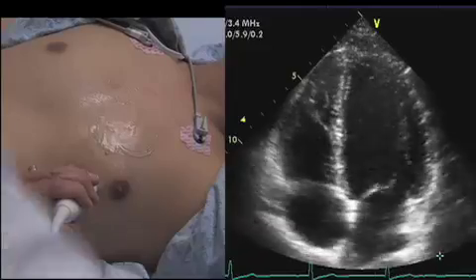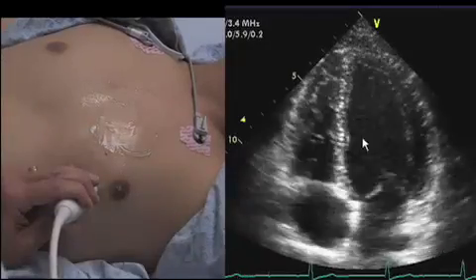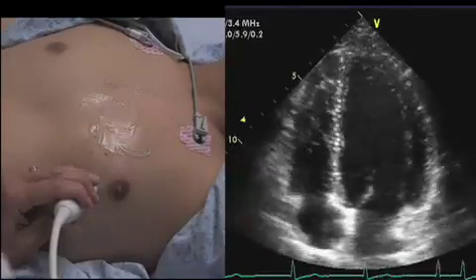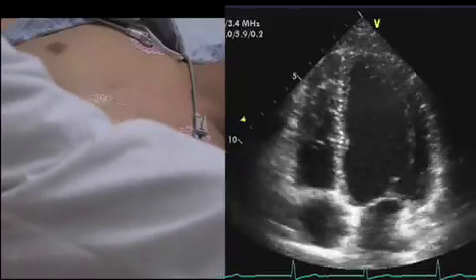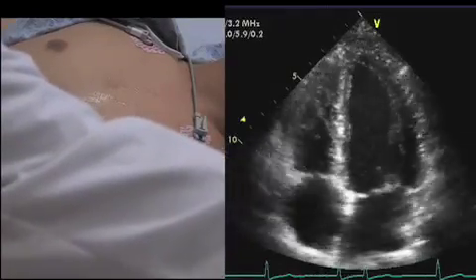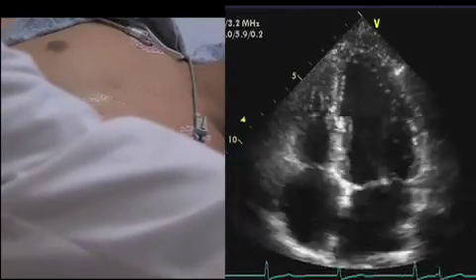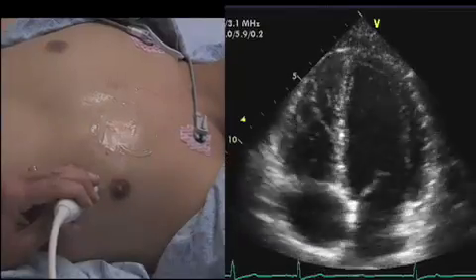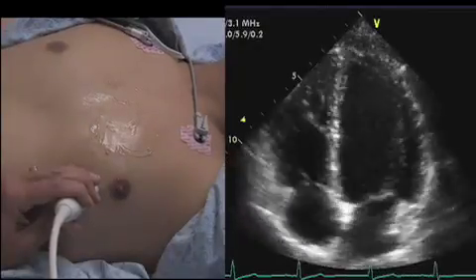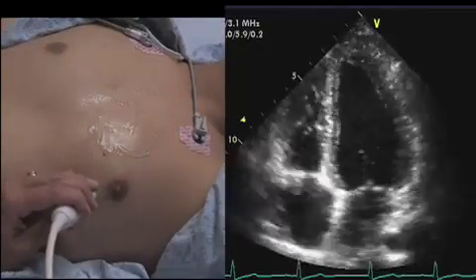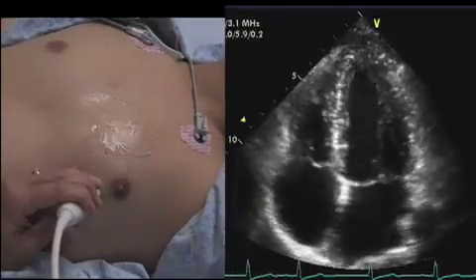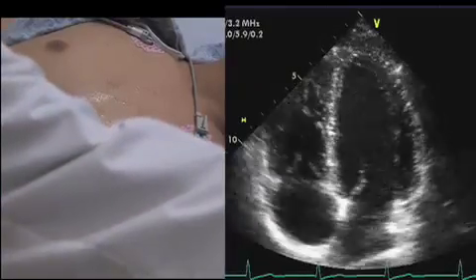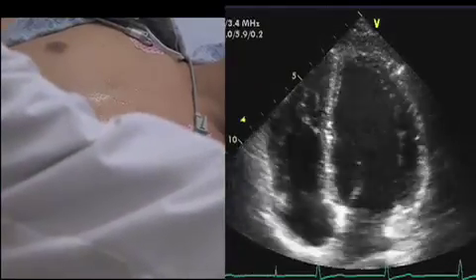We want to make sure we've adjusted our frequency to optimize the best detail of the endocardium as well as nice valve detail. You don't want too low a frequency when you're focusing on fine structures. The highest frequency you can use is always the best way to go.